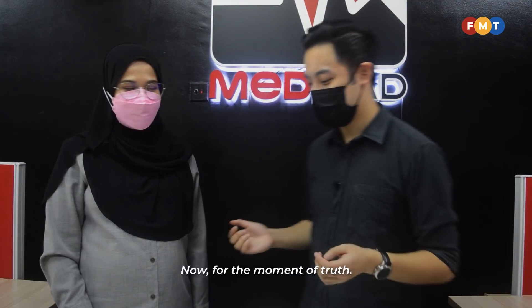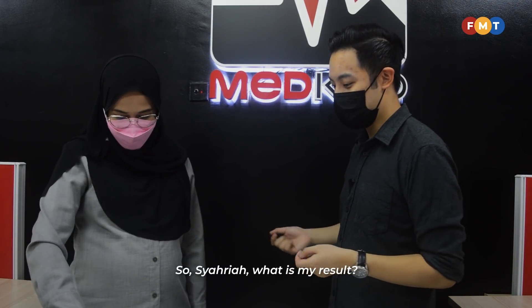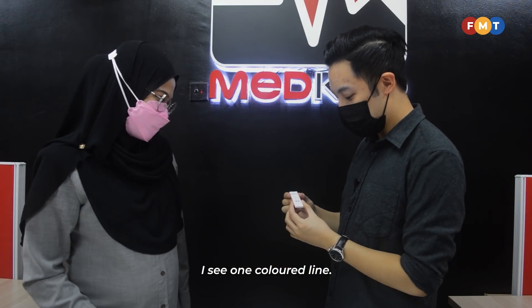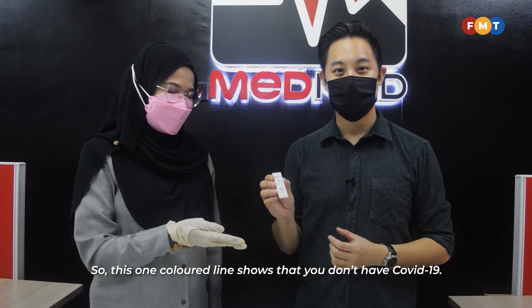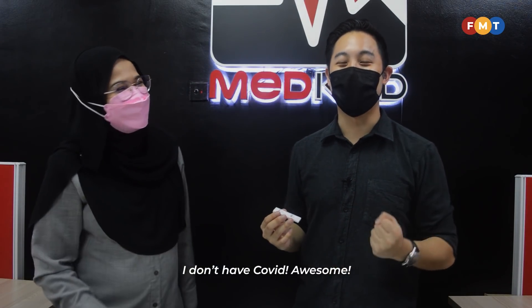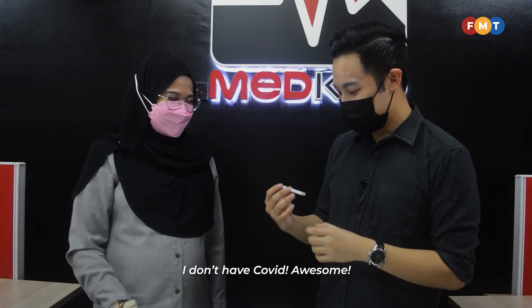Now for the moment of truth. So Shahriah, what is my result? This is your result — I see one colored line. This one colored line shows that you don't have COVID-19. I don't have COVID! Awesome. Congratulations. Thanks.